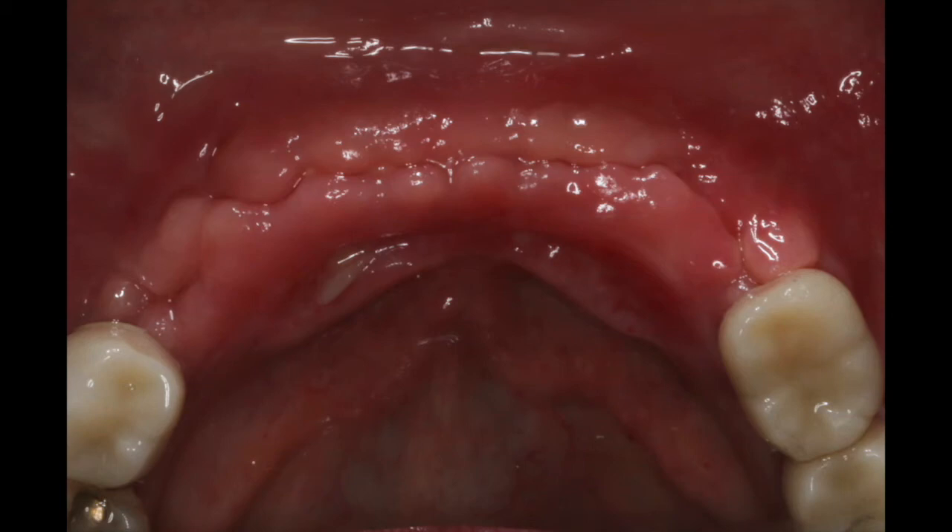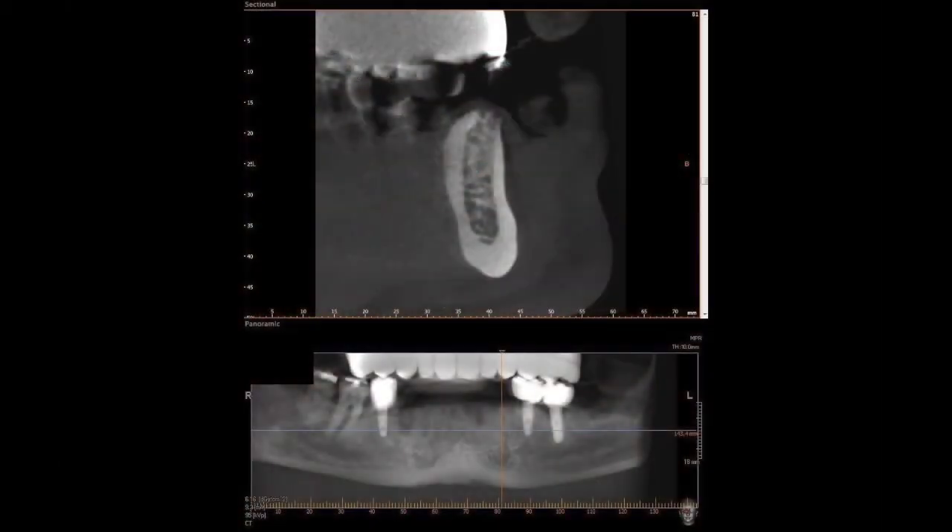Just beautiful, beautiful healing. After about seven or eight weeks of integration, we decided to take a CBCT to evaluate the regeneration of bone in that area.